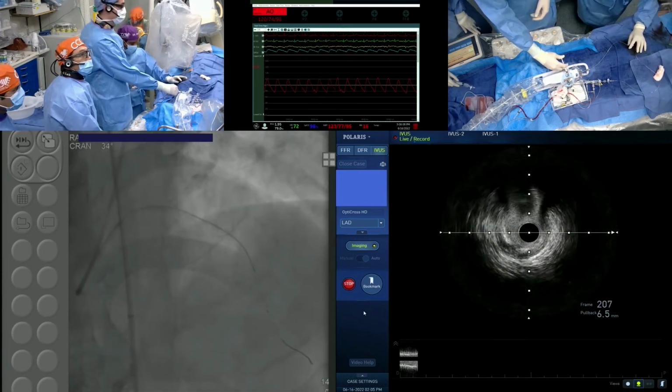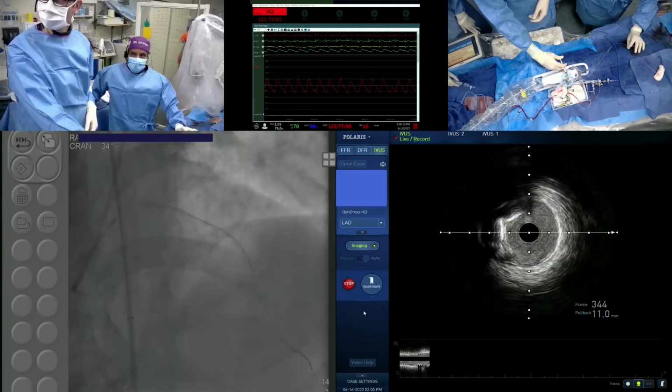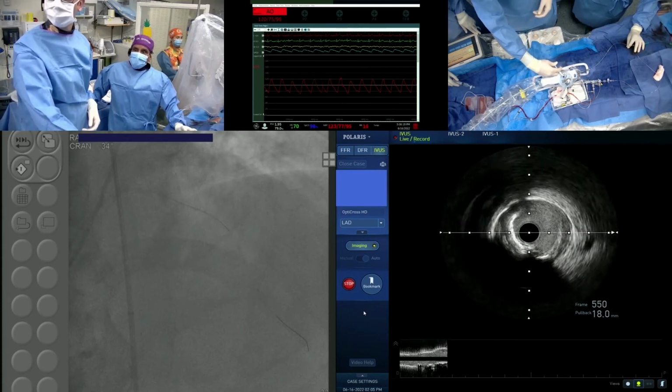Yeah, now the calcium plug starts. One quadrant of calcium, some branch. Yeah, the lumen is getting bigger. Here it is like 3.5, or like an aneurysm part. But at least there is a cut, right? There is no circular calcium.